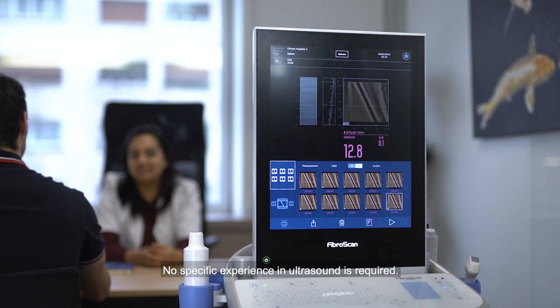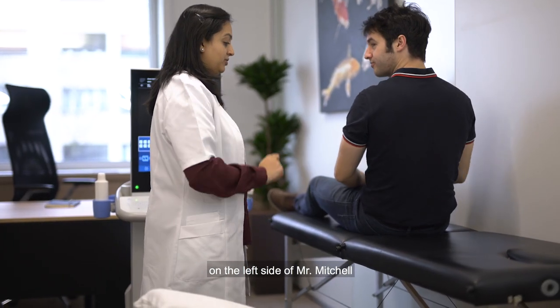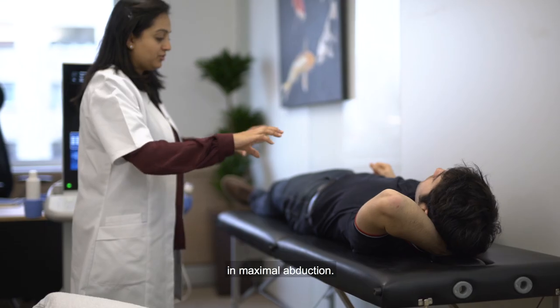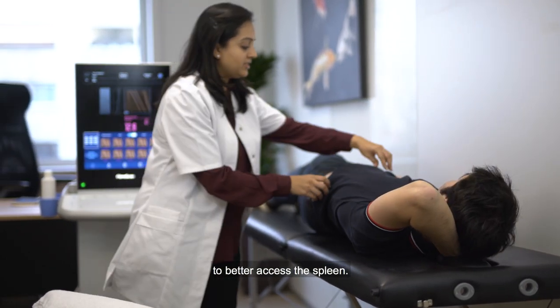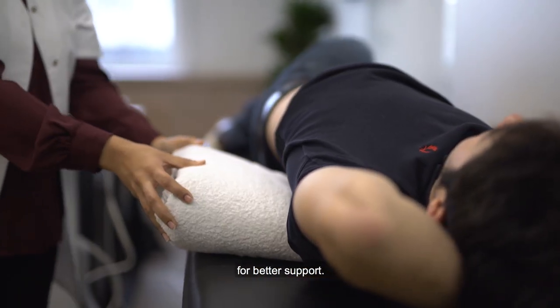No specific experience in ultrasound is required. Mr. Mitchell will have a spleen stiffness examination today with Mrs. Shannon. The examination will be performed on the left side of Mr. Mitchell, who should lie on his back with the left arm behind his head in maximal abduction. It is recommended to partially rotate Mr. Mitchell to better access the spleen. A wedge cushion can be placed under him for better support.